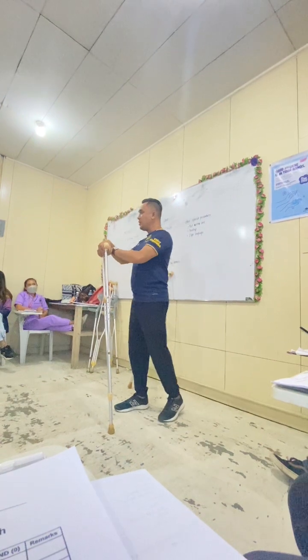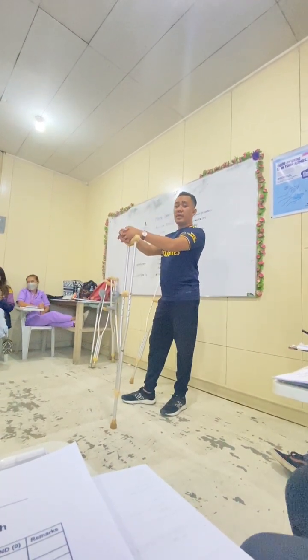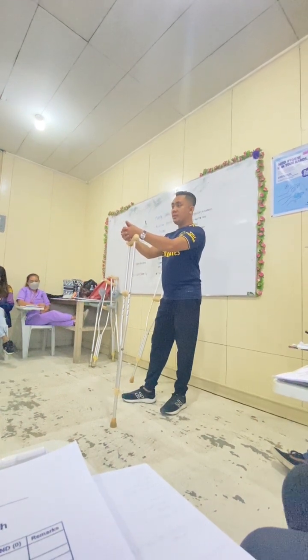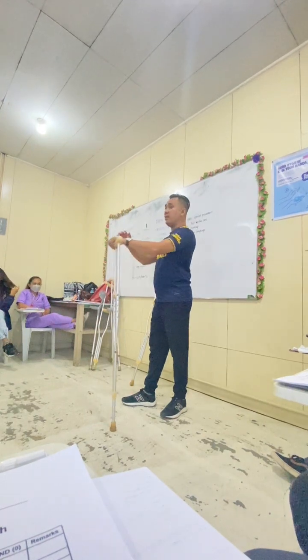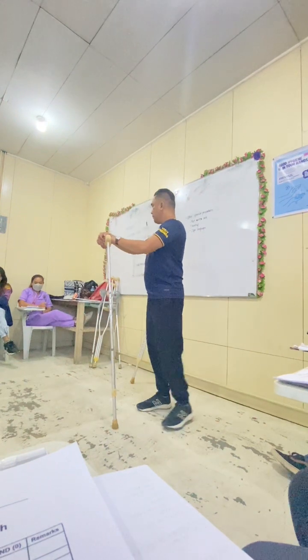Okay, next is wash, perform hand washing. Next is prepare the necessary materials. So prepare your axillary crutch and check if there's any damages. Next is let the patient stand straight.